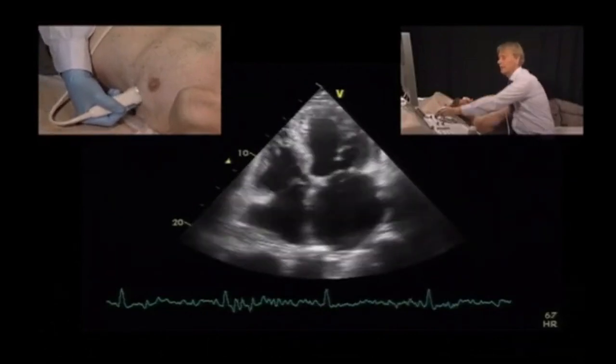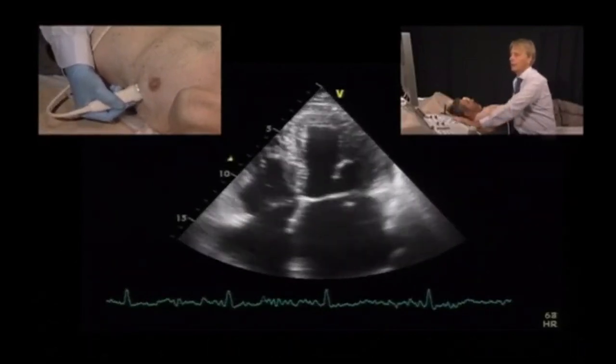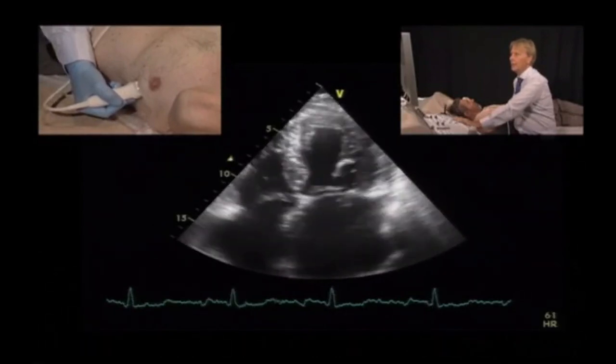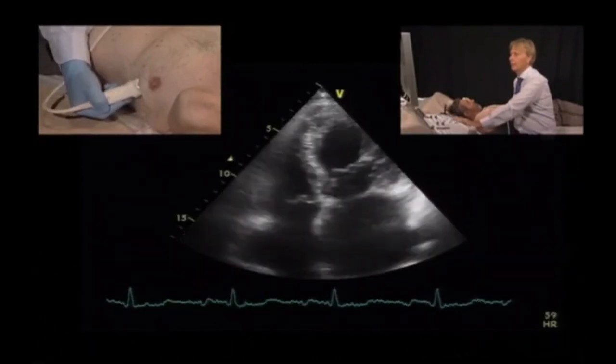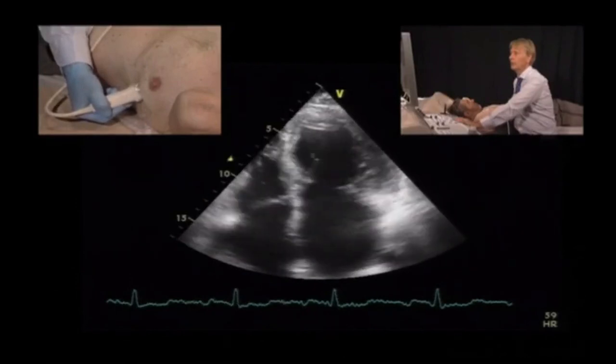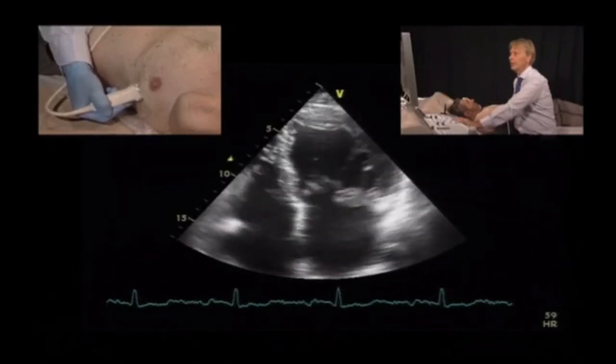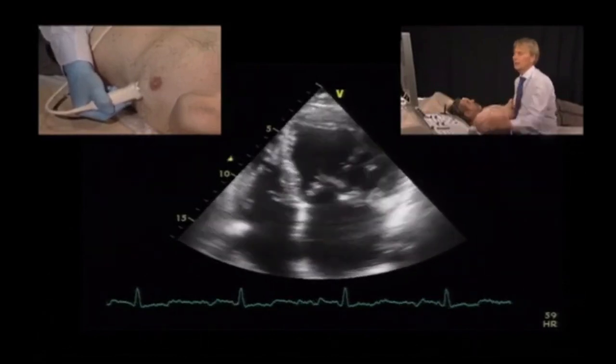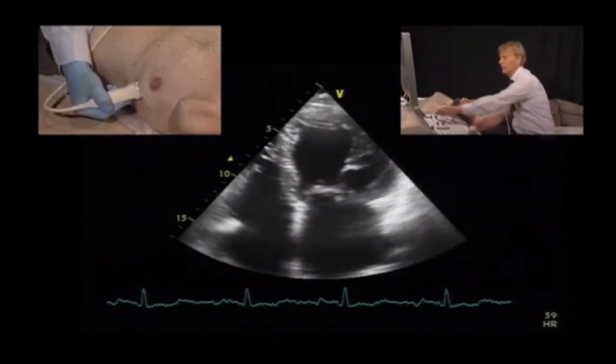So it's clearly apparent that the left ventricle is hyperdynamic and also dilated. We measured an end diastolic volume of 205 milliliters. So, a classic volume overloaded left ventricle.